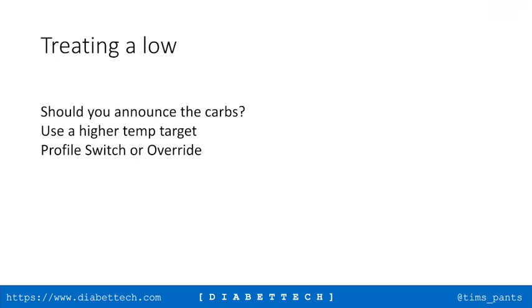Main point for me is being low. I always have the feeling if I eat carbs, they must react immediately, even though I know they don't. So for me, it is always the risk of eating too many hypo carbs, bringing me way up again. So that's why when I announce carbs, I announce only part of what I ate.